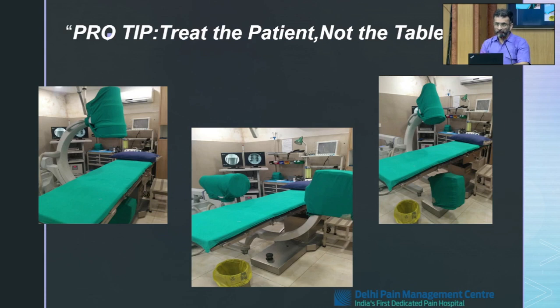So how do we get an AP? We take a structure bang in the middle of the spine, which is the spinous process. And then we take structures which are on the lateral surfaces and equidistant, which are the facets or the pedicle. So the spinous process has to be equidistant to the pedicle on both sides.